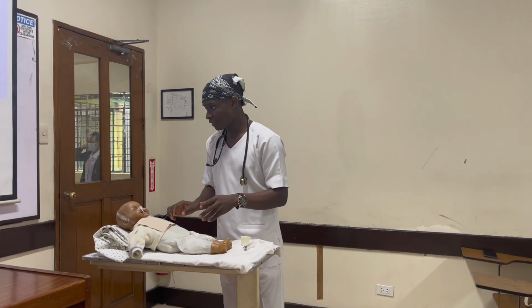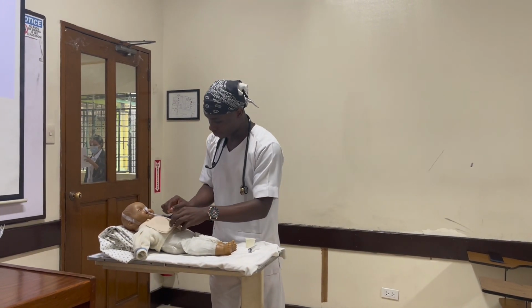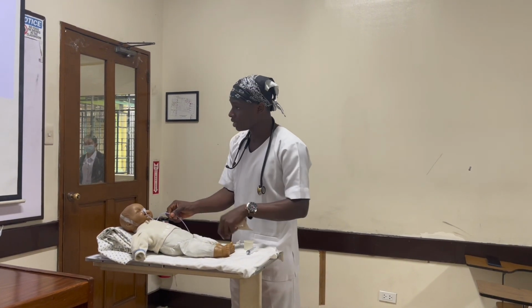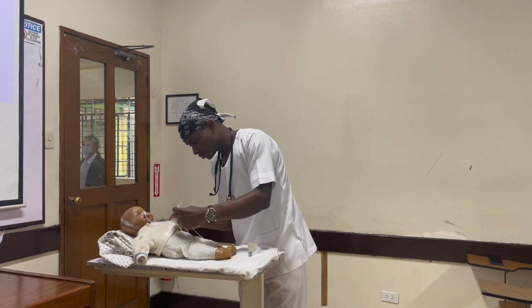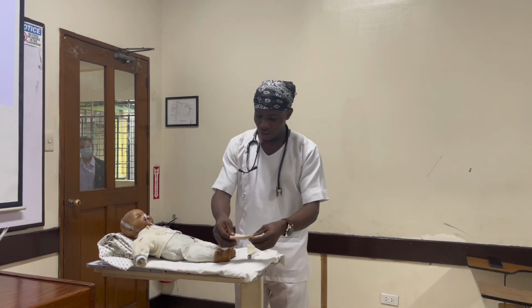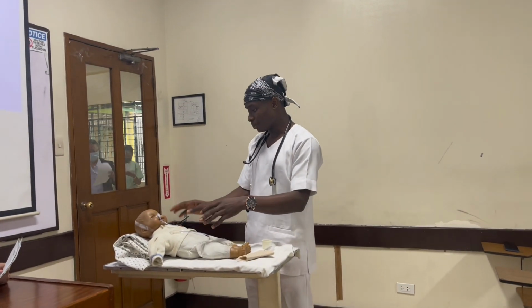Then after doing this, the next step is to clean up the baby. Then make sure I place the NG tube in the right placement with tape. Then what should be the next? The next is placing the baby.